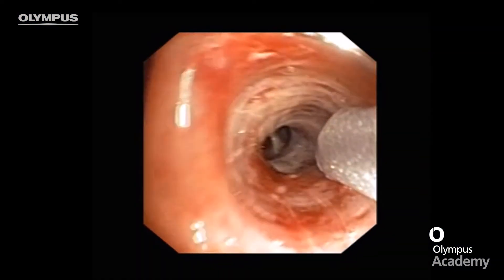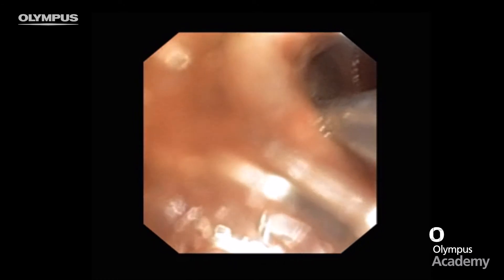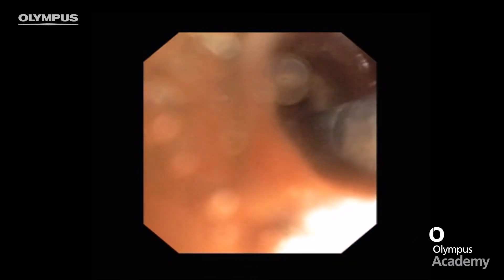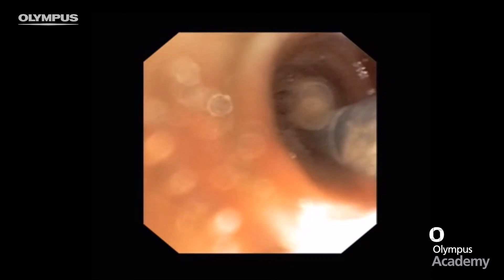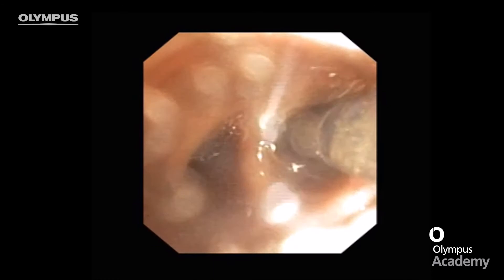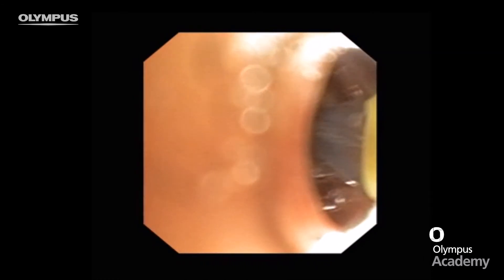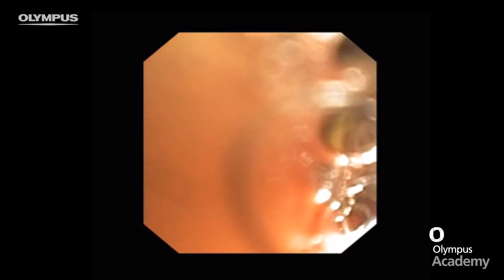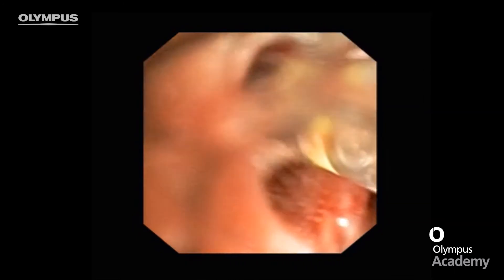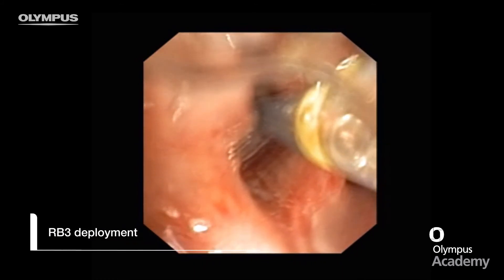The next step is determining the order of valve deployment. I generally like to deploy the valve in the most difficult segment first. I also aim to avoid the removal rod stems crossing each other, which could interfere with valve function. In this case, the first valve — a size 7 — is deployed into RB3.